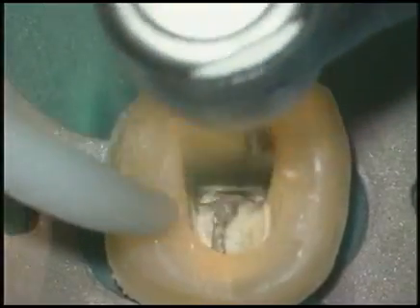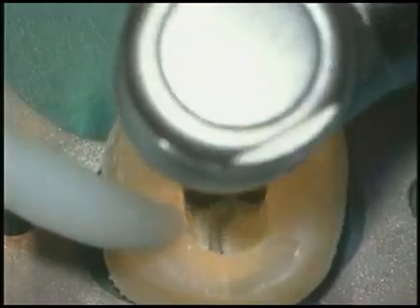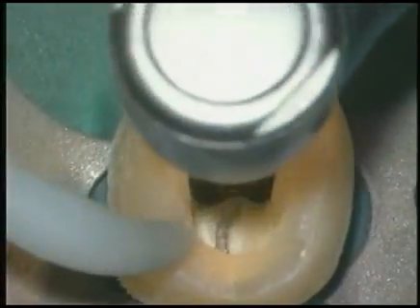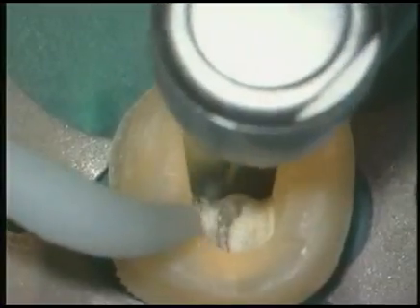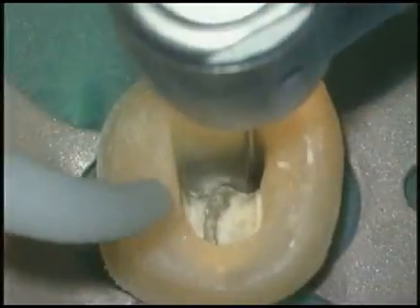Smaller GGs then are used in a crown-down manner. These GGs are tapped very lightly into the canal. I want to emphasize the light pressure that we use the Gates-Gliddens with. It would be analogous to writing with a pencil without breaking the lead.